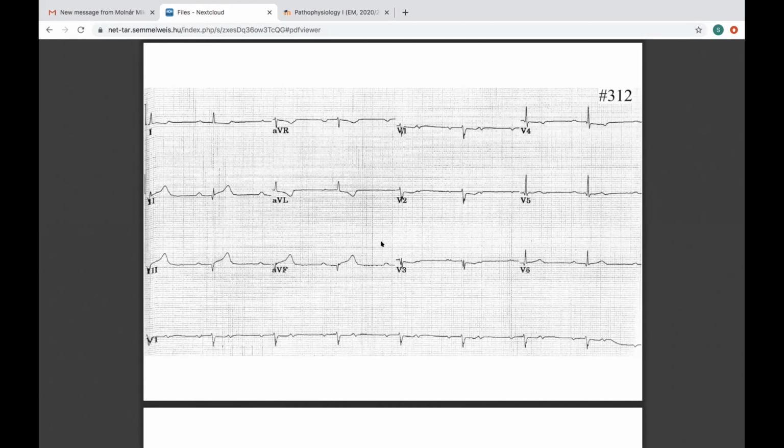Okay, don't forget it. I'm going to take over and share my screen because I can enlarge it.